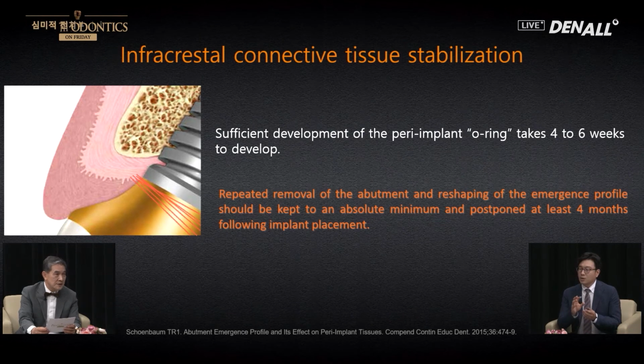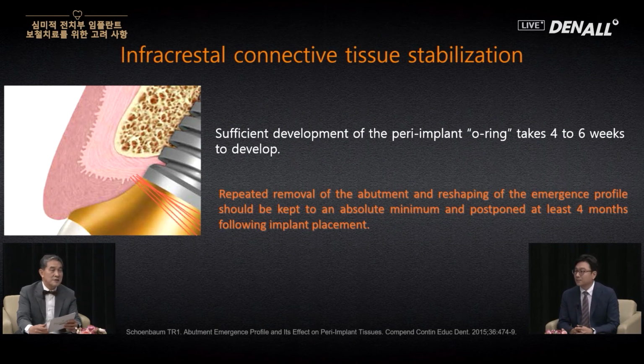Repeated removal of prosthetic parts there can interfere with the creation, so I use wax up for the provisional. The gingiva surrounding the implant doesn't like to get pressure, so we should not give stress or pressure on there. That's important.